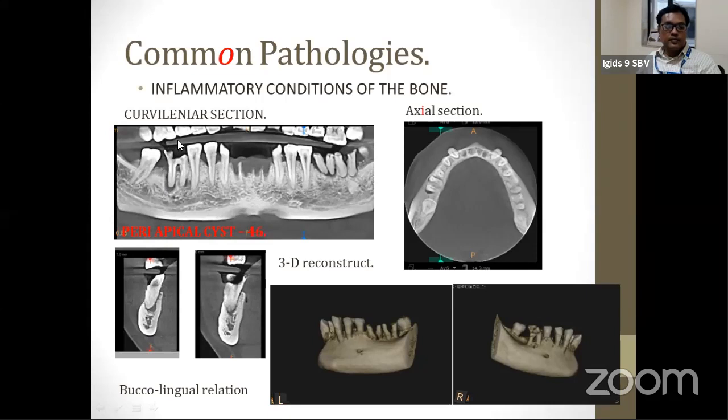Take a look at the six, typical periapical radiolucencies, both the mesial root as well as the distal root. You may not get this image, to this resolution, even on an IOPA, right? It's perfect with its size, its shape, and its existence. So this image is telling us in reality how this particular lesion is. This is one point that we are going to discuss today, this tooth.